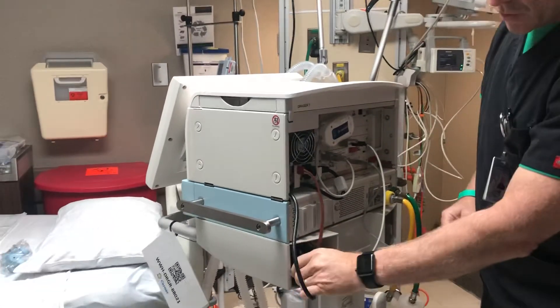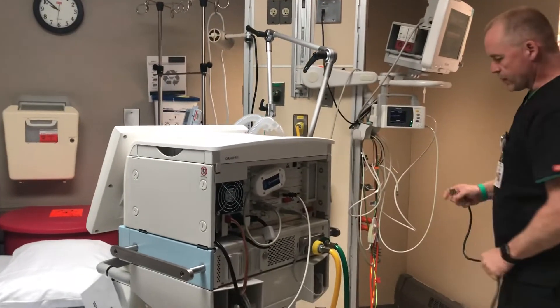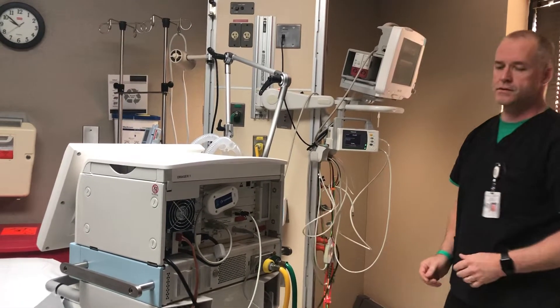We'll also have the electrical cord here. We'll pull it out and plug it into — if you have a red receptacle, that would be better. But here for presentation purposes, we'll just go ahead and plug it into the regular circuit.